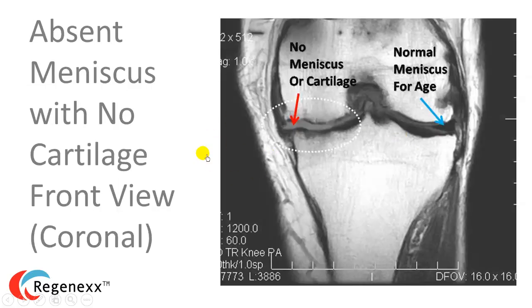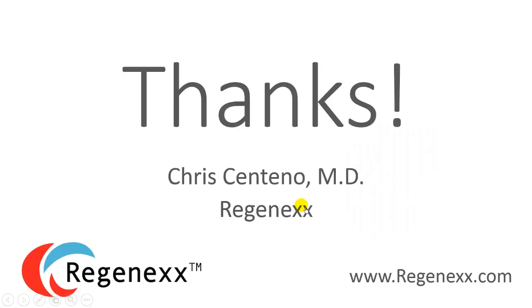An absent meniscus with no cartilage whatsoever — you can see the nice normal triangle on one side, while this one is completely gone. There is no meniscus there, and there is no cartilage either.